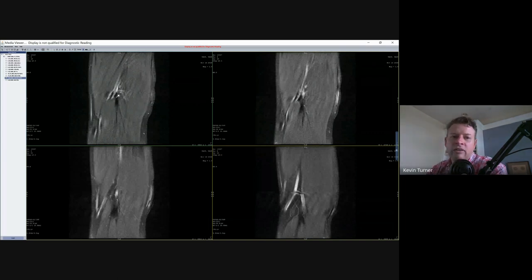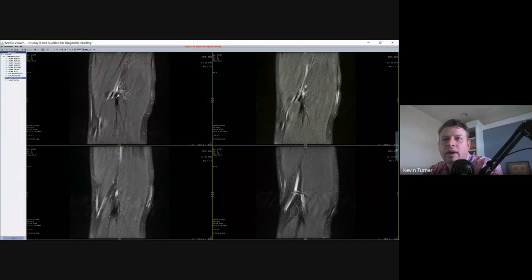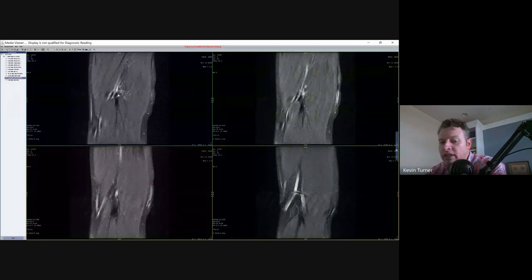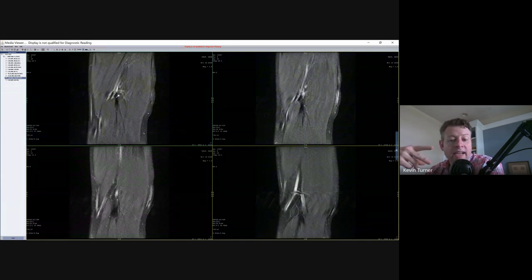So a lot of times when we scan, you'll notice that you copy information from one scan to the next scan because you're copying the gradient information. If I run a coronal, if I set up my coronals, the second set of coronals, I simply copy all of the gradient information. Where the slices are, what the matrix is. It gets copied from one set of images to the next. So I can have two sets of images with the same contrast, but different resolution. And then sometimes we make images with the same resolution, but different contrast. We run two axials. Both axials have the exact same gradient information. Same slice thickness, same placement of the slice, same matrix. But the TR and TE are different, so they look totally different.